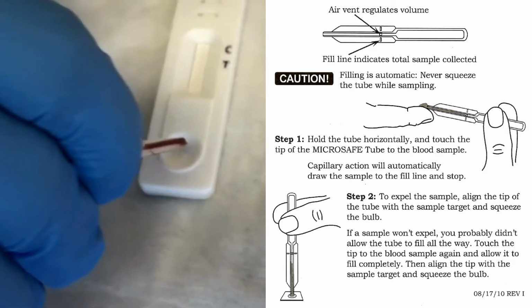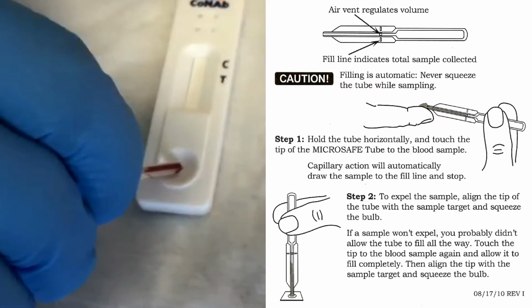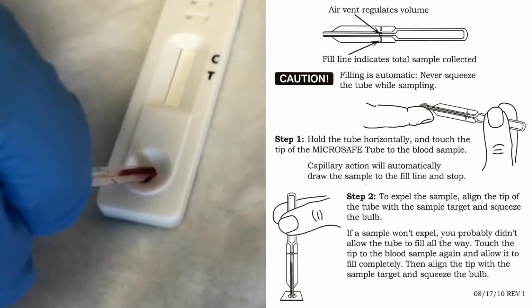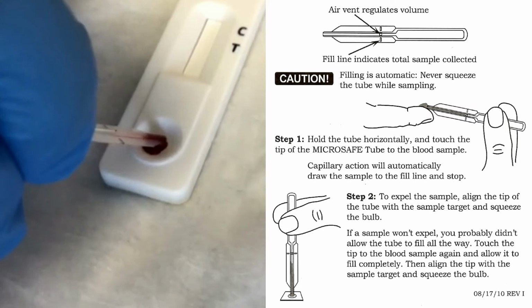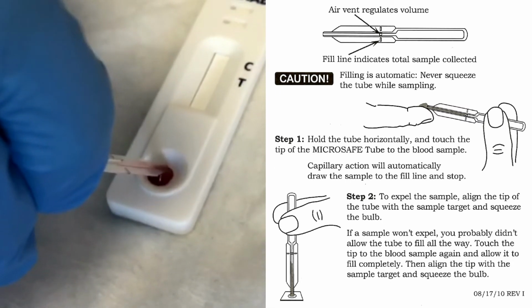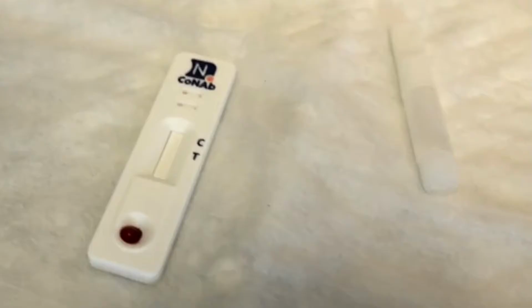Fill the pipette to the black line shown on the tube while being careful to avoid touching or squeezing the transfer pipette bulb at the opposite end. If more blood is required, gently massage the finger in the direction of the puncture to increase blood flow.